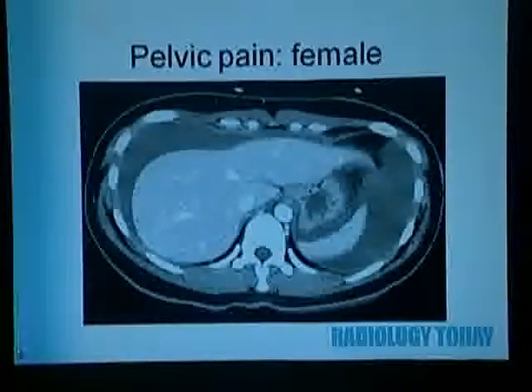Now, this is not to say that CT cannot diagnose pelvic pathology. It's just not as good at characterizing it, okay? This is a young woman who came into the office. She had acute right lower quadrant pain. Appropriately, CT was ordered, given with IV and oral contrast.